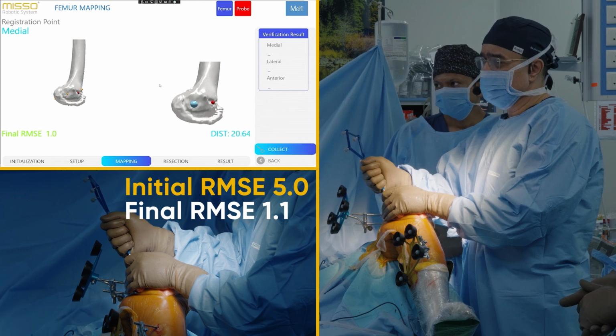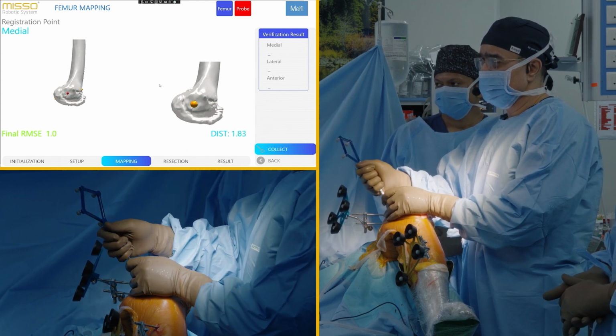Final RMSE is 1, which looks good to me. Go to tibia.